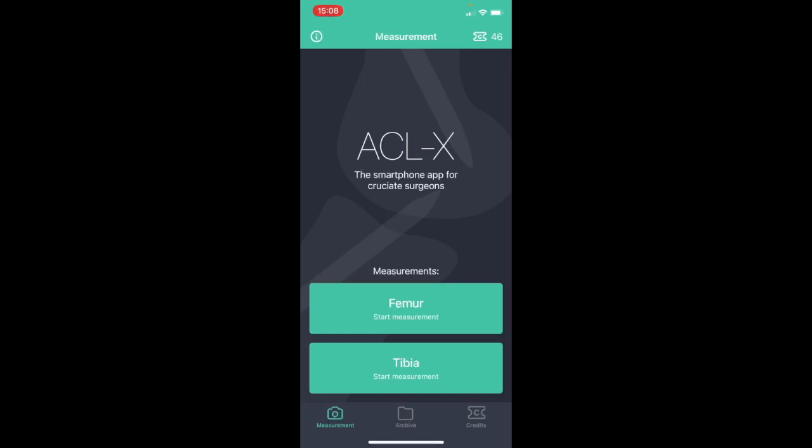Using this app you can easily analyze fluoroscopic images according to the method of Bernard and Hertel.